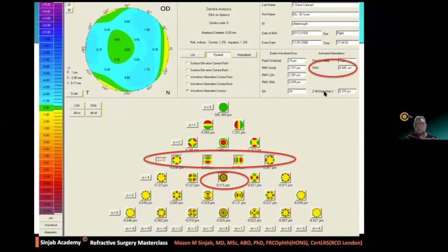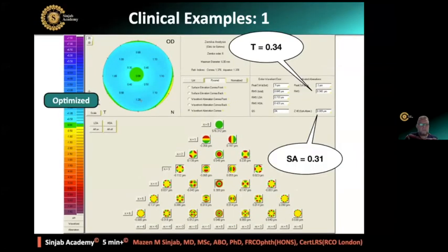Now, the spherical aberration alone here is not displayed in RMS. It is displayed in what is called Zernike coefficient. This is why you see Z40, Zernike coefficient, all right? Of course, I'm not going into details in this very quick lecture, but however, remember, the Z40 means Zernike coefficient. Okay, this is an example.